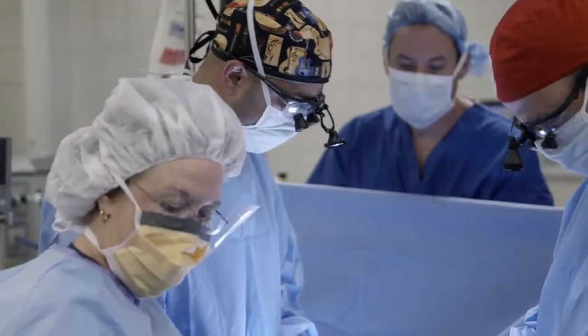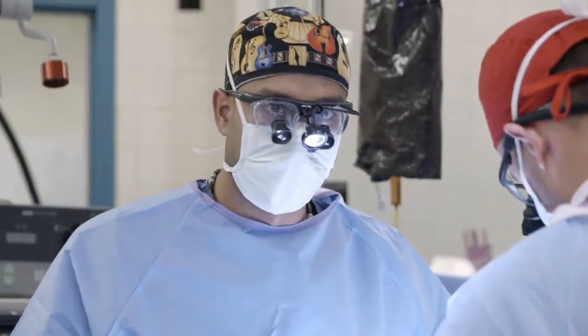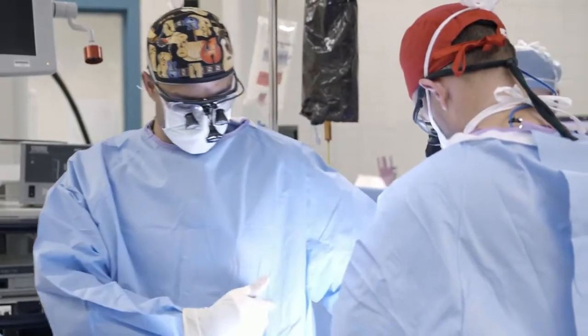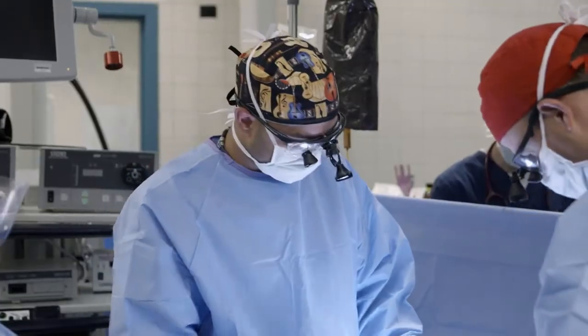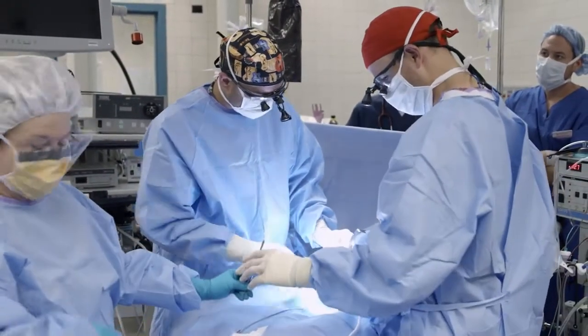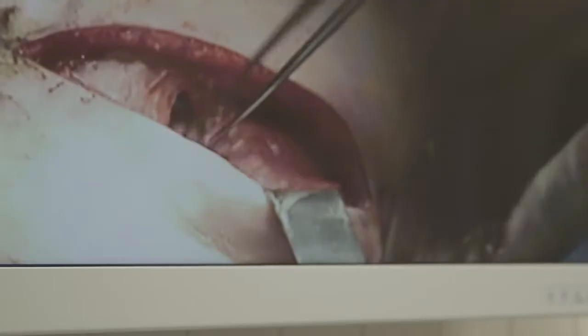So now we're going to enter the abdominal cavity, what we call the peritoneal cavity. She's missing the diaphragm along the chest wall, starting from about right here, going all the way around to her back. And so she's still going to do well with the muscle flap as opposed to a primary closure. This is our muscle flap here. It now is hanging off of the rib cage.